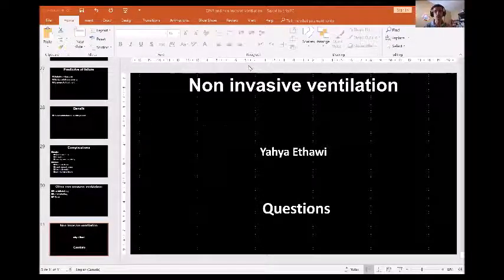So it depends on the interface with the tracheostomy, which one you're using. You should have the interface connected to the tracheostomy, because I didn't talk about that. That's a different subject. We're talking about ventilation, not tracheostomy. So you can use just flow to provide oxygenation if your CO2 is okay with tracheostomy. If your CO2 is not okay, you can use CPAP.